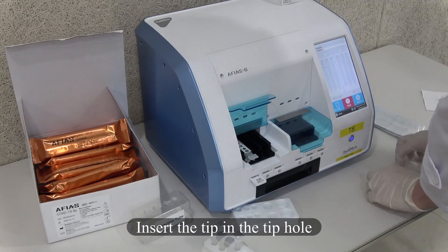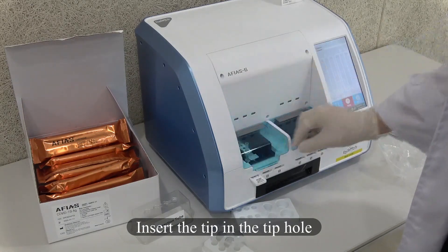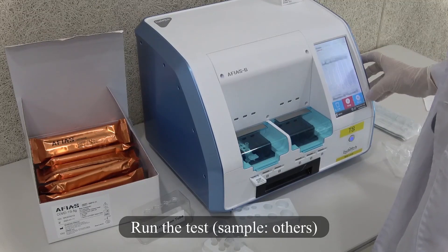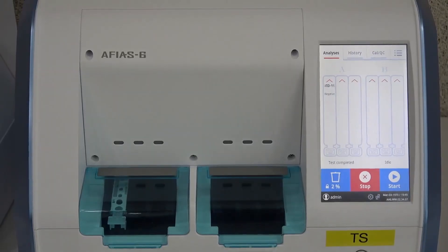Insert the tip in the tip hole. Run the test and choose sample: others. After 12 minutes of incubation time, the device will display the result — positive or negative.